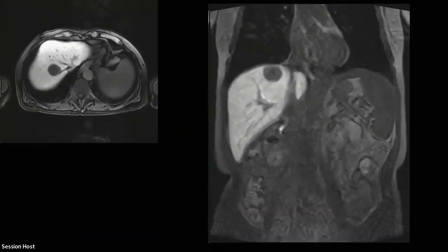I'm not going to go through every one because we kind of talked about this. You can burn, obviously, larger tumors. This is an MRI of a person. This person had multiple tumors, but this was the most problematic of them, sitting on the right vein, essentially just adjacent to the vena cava.